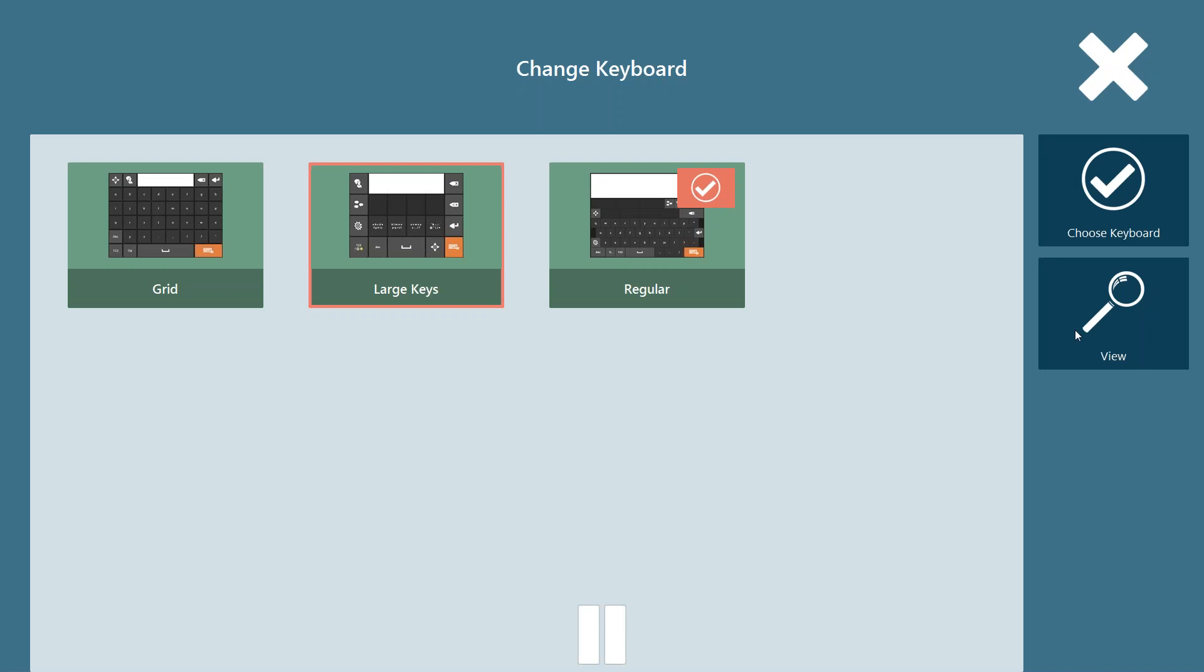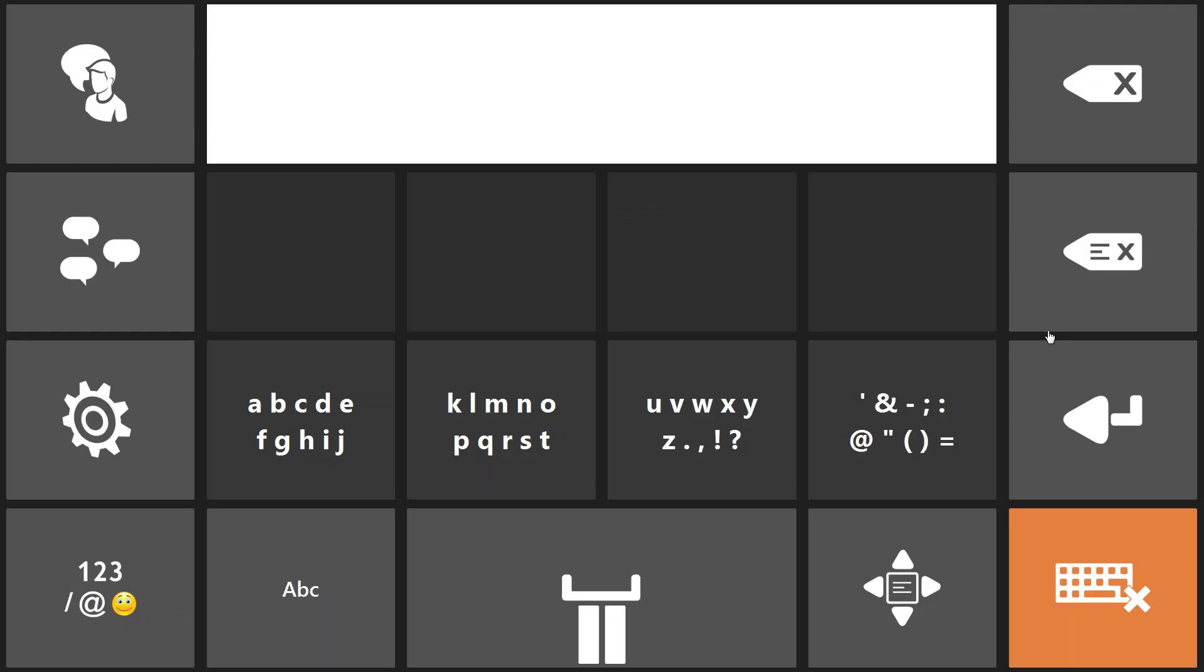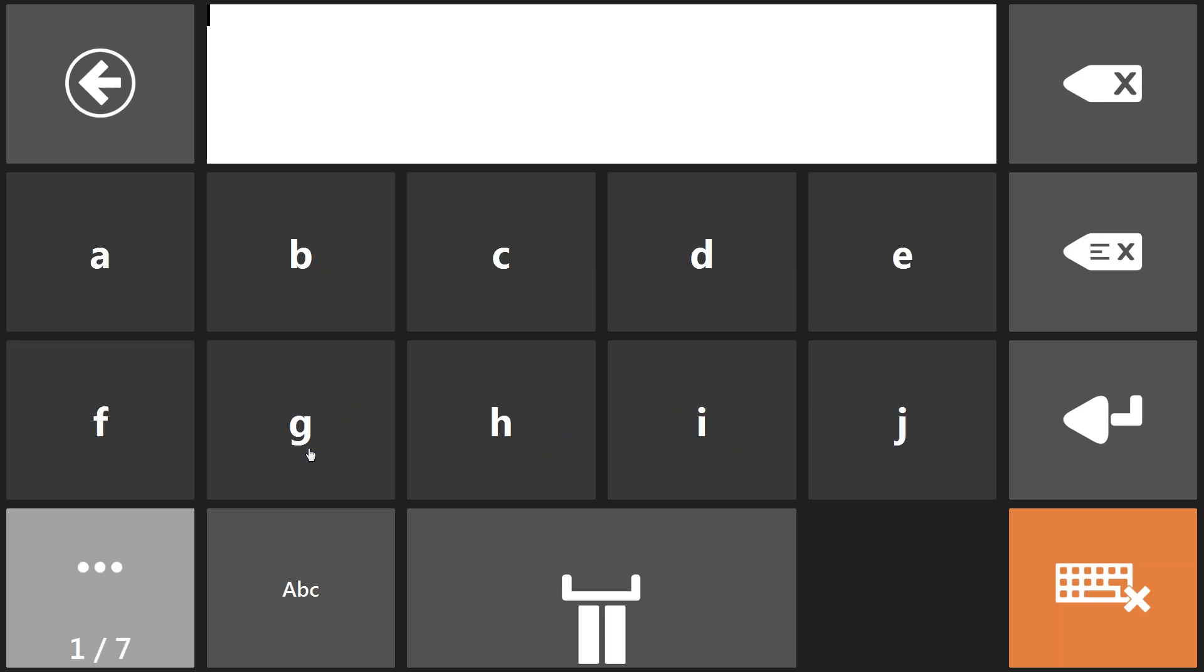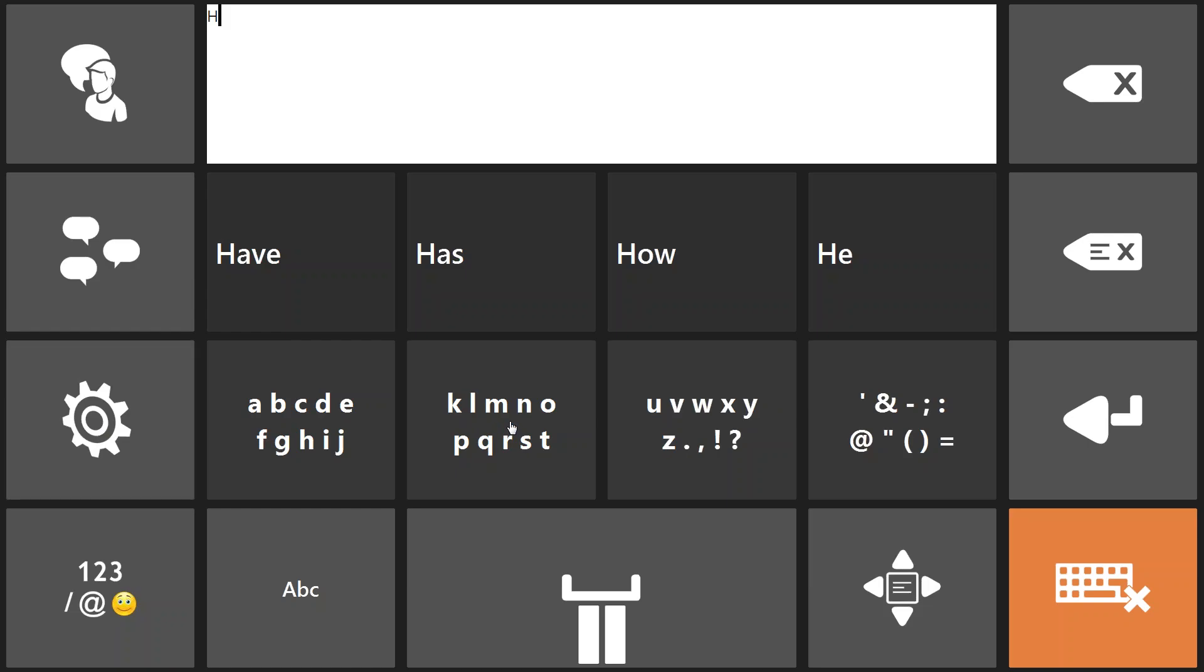Or you can go to large key. Large key shows you different sections of the alphabet in which you would select the letter you're looking for. So if we were spelling hello I would use this first box here because that's where the H is located. Once I go in the buttons get rather large, they have nice spacing between them, and it makes it easier for me to isolate that H. Because ultimately our goal is communication, so if we're struggling on one of the smaller keyboards with smaller buttons it may be a good idea to start with a larger keyboard and be able to actually communicate rather than getting frustrated with the device.